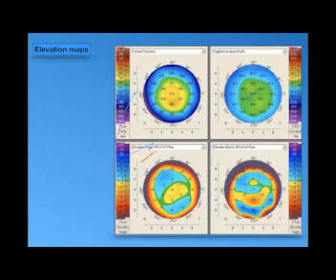If there is high astigmatism, the astigmatism itself, because of the difference between the two curvatures of the cornea, will convey some refraction, or it will interrupt the path of the rays. So the astigmatic cornea may show abnormal elevation maps on the best fit sphere. So it's calculated by the module called ellipsoid map.